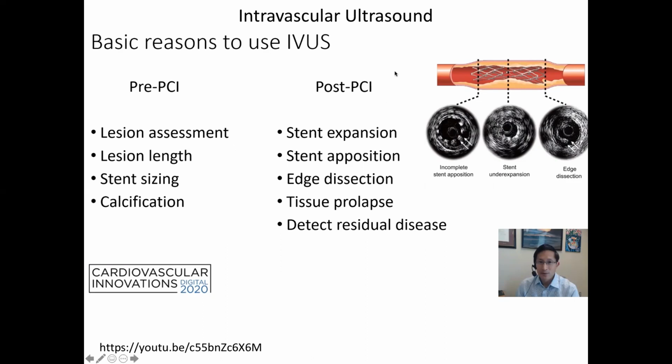And then after you've put in your stent, you can push the catheter back in there and see how things are going, right? Here, things aren't going well in that the stent has not been blown up to its full size, right? And so there's a gap here. So you don't have stent apposition. So you want to go back in and blow that thing up, right? Under expansion, again, the whole vessel is still kind of closed, right? So you really haven't done the patient many favors by just leaving the darn thing closed.